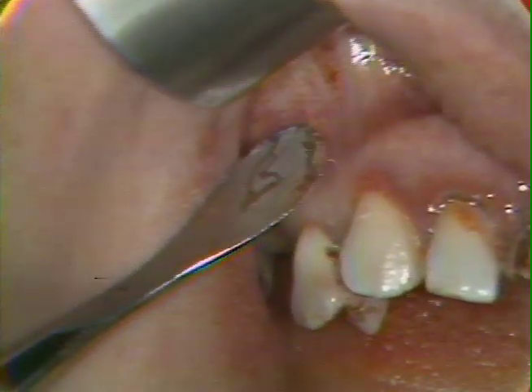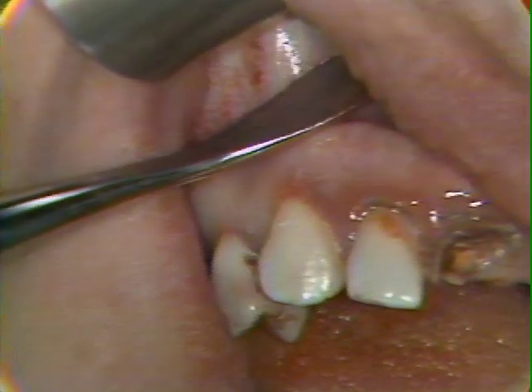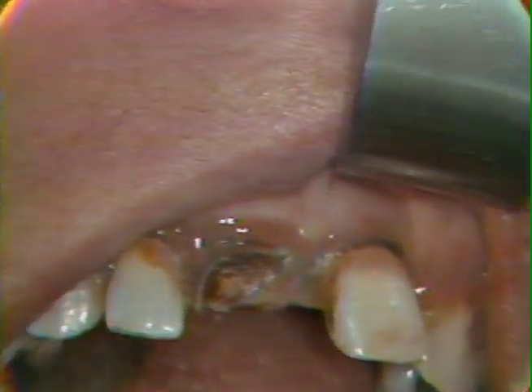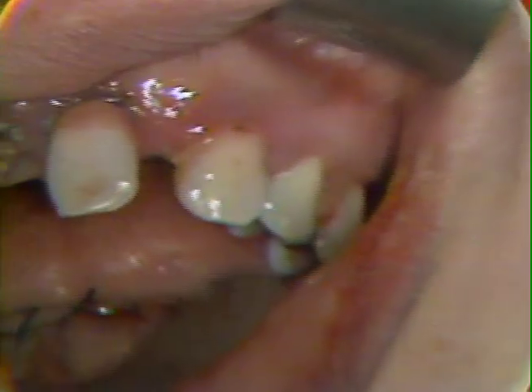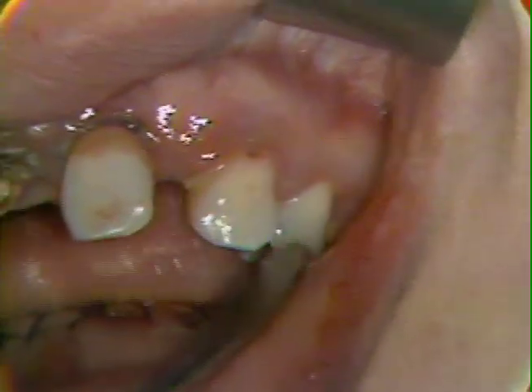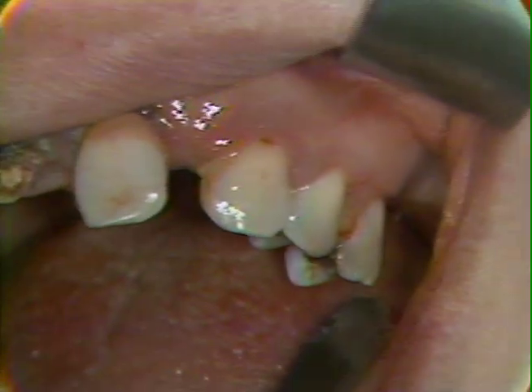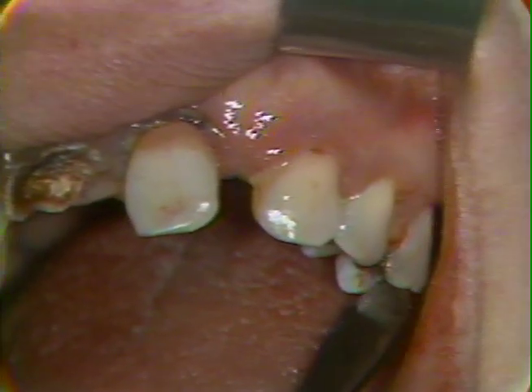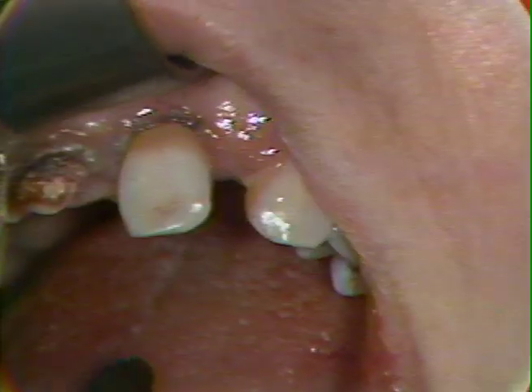That also will be true around the canine region here, farther forward, and also around, just turn a bit toward me, Ms. Selvey, around this maxillary canine on this side. We have these bicuspids to think about. Before we proceed, let's have a look at the x-rays of these teeth to get us oriented.